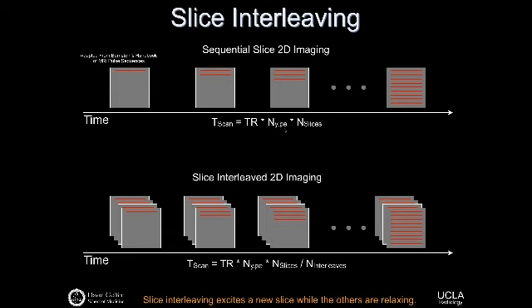And then if we have a multi-slice protocol, because we want whole brain coverage or whole knee coverage or whatever, then we also have to multiply by n slices. And so all of a sudden this can become a 30-minute protocol or 45-minute protocol. It sort of compounds itself pretty quickly.